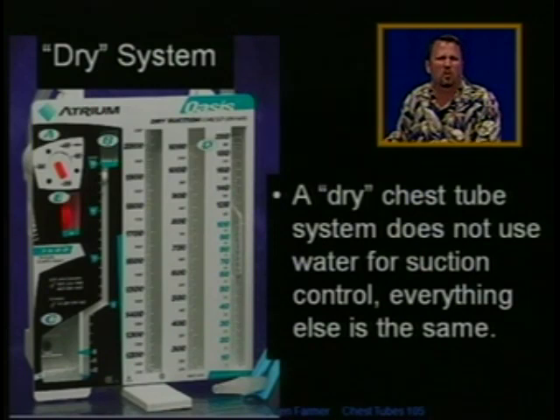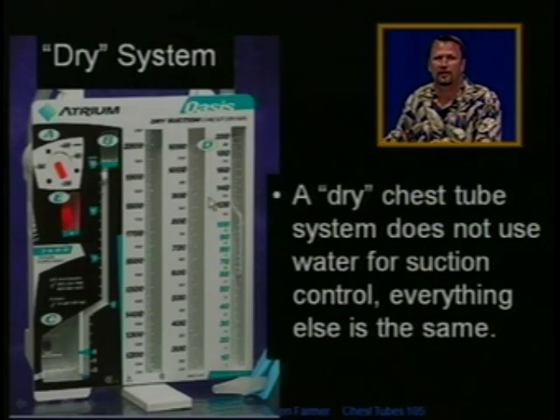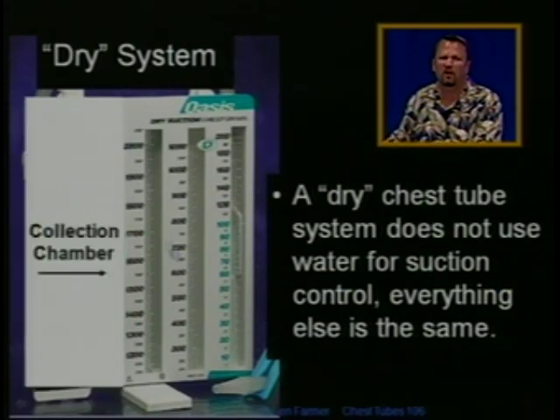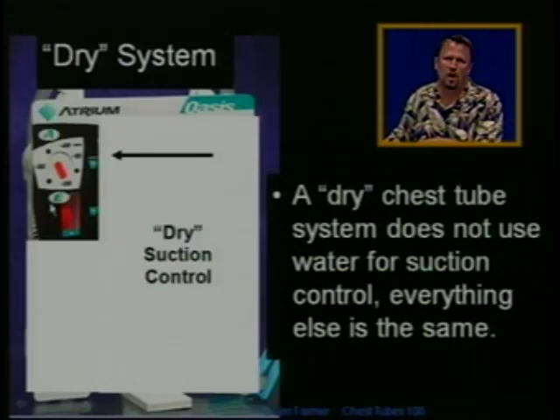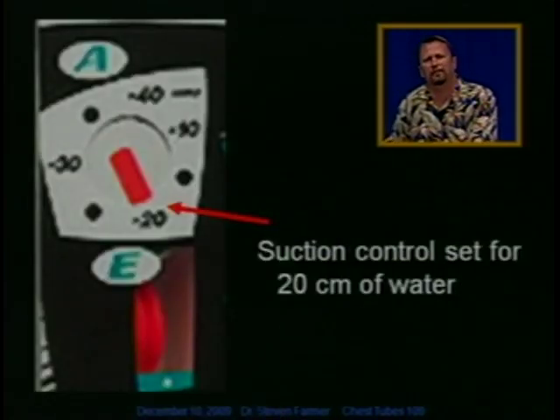Something we see more and more used is something called a dry chest tube system. It's exactly the same, has a collection bottle and a water seal, just like every other system. But here it has dry suction control. So here's our collection chamber. It's exactly the same. The water seal is exactly the same. But what's different with this system is what's called a dry suction control. And so we'll blow that up.